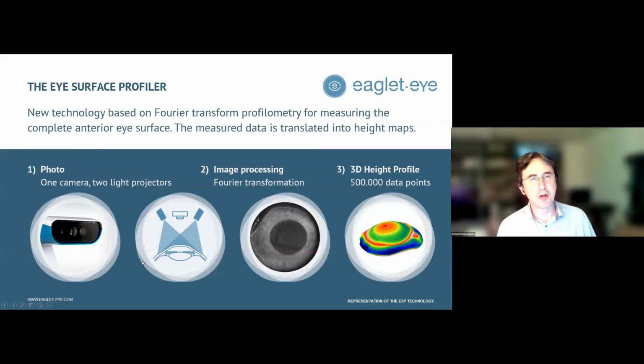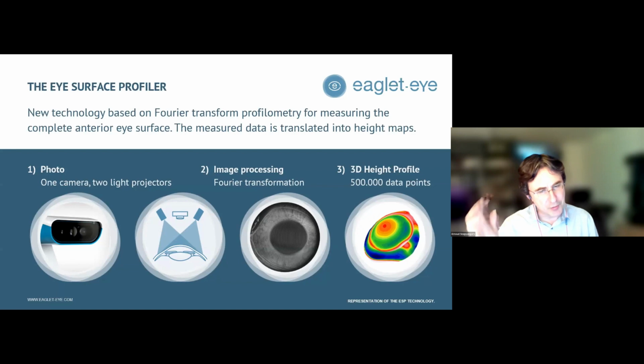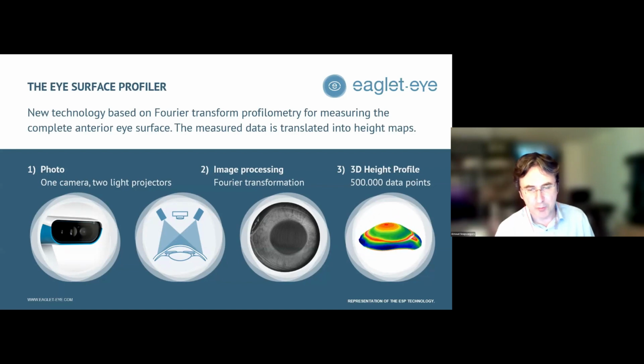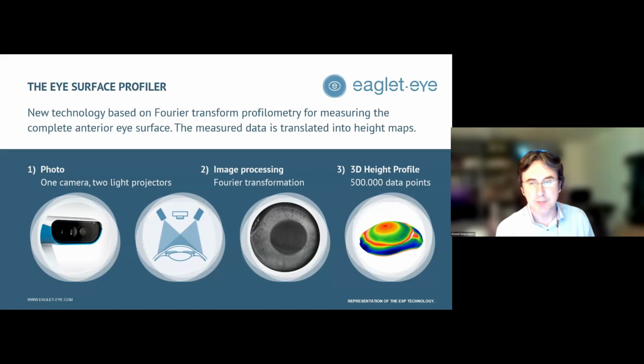So the technology is called Profilometry, and what makes that tick is the magic factor X: there is fluorescein that is instilled onto the tear film. So when we then project from 2 sides, we project a line pattern of cobalt blue light. Now, when that cobalt blue light hits a fluorescein molecule, it gets scattered back in all directions, and also, of course, then into the camera of our system. And that's the image you see, the second one from the right.